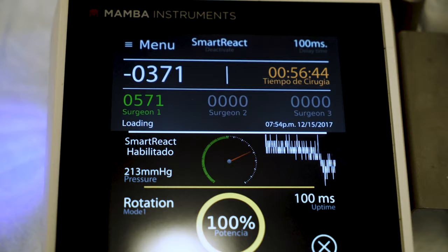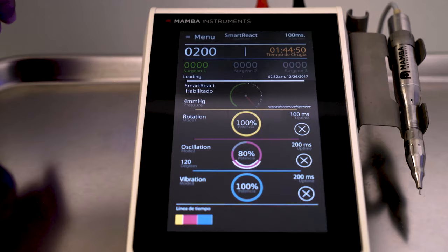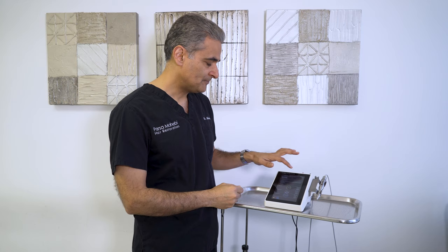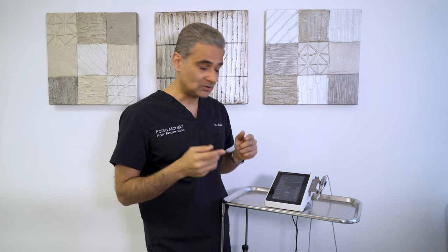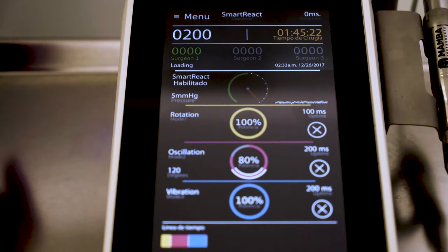There is also a smart react function. Smart react means the machine starts working when you touch the skin, so you don't have to keep using a pedal. The system recognizes when it's time to start rotating or oscillating based on your settings. When I activate smart react, the system knows what to do — the moment the tip of the punch touches the skin, smart react gets activated.